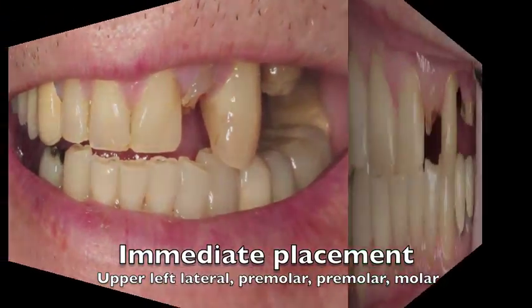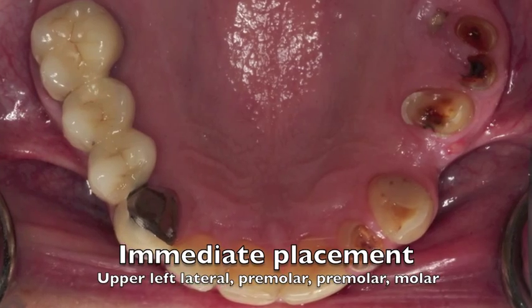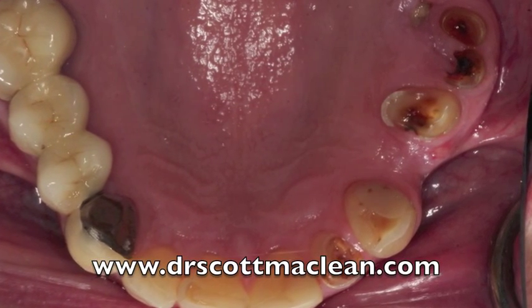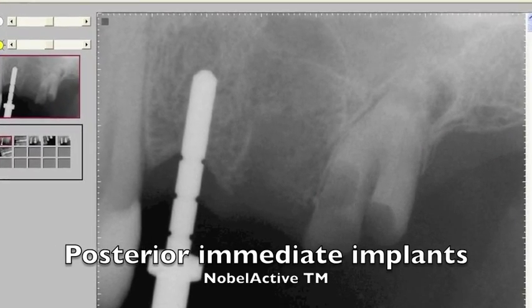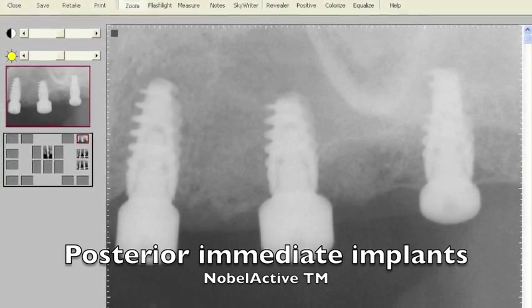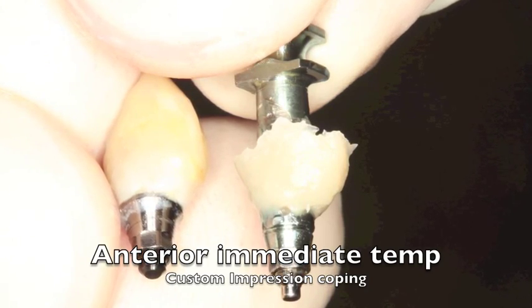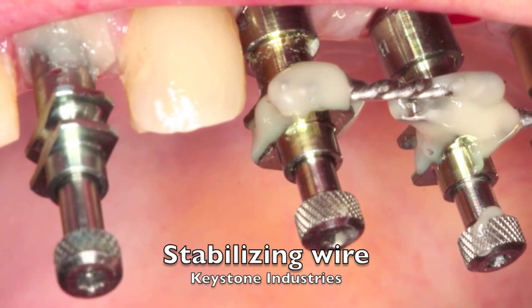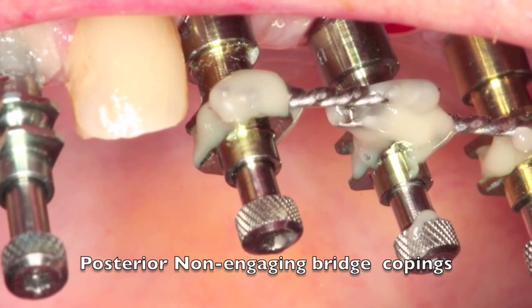We're going to review the case first. This patient came in with three bad teeth. We ended up placing four implants — three in the posterior, one in the anterior. They were all placed immediate with no load, except for the anterior one which did have some load. The three posteriors were placed with healing abutments and then we waited for them to heal. We took impressions of the anterior plus the posterior using stabilizing wire from Keystone Industries, which enabled us to get a nice impression.